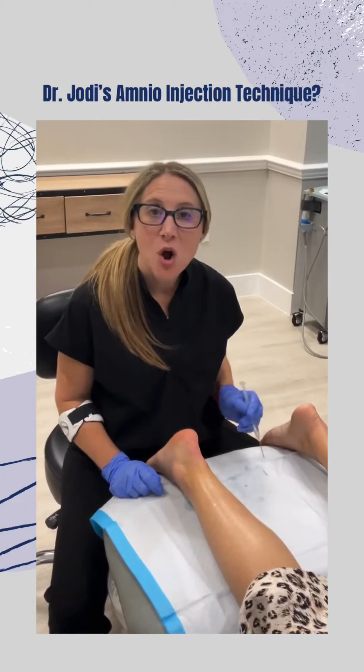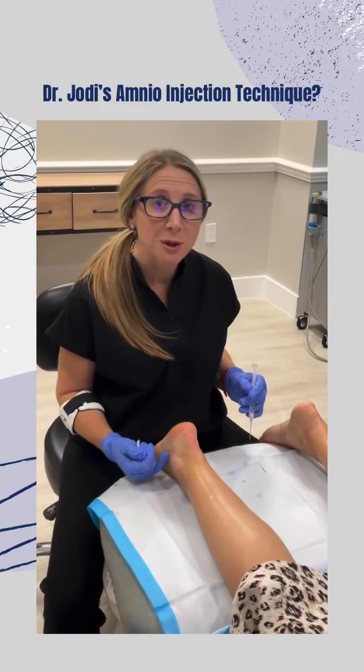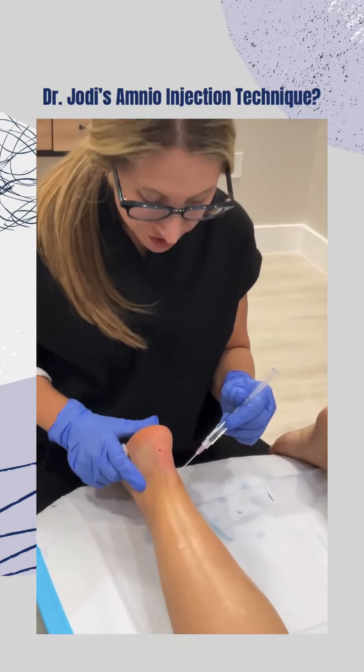Now it's time for treatment. I like to use a microneedling technique along the course of the tear and a little bit above and below the tear, delivering droplets of the amnion into the tendon itself. The patient is numb.